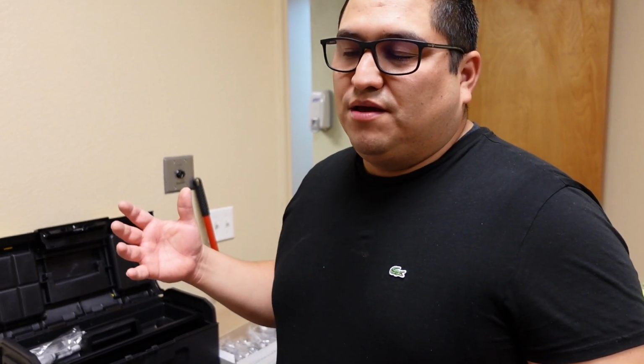So what we're doing right now, we're putting together the crash cart. People are really curious about this crash cart, myself included. For this specific study, we're going to need 3 different medications. One of them is the epinephrine, which I'm assuming most studies will need. Hopefully there are no reactions, but it should be prepared. There are also the atropine and the dopamine, because the medication could have some cardiac adverse effects. This is a phase 2B, so if it's not safe, it wouldn't progress, but it's part of the protocol.